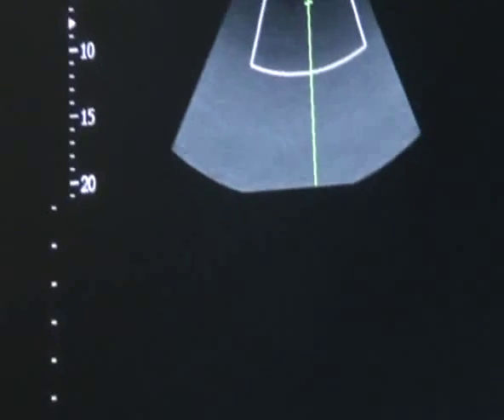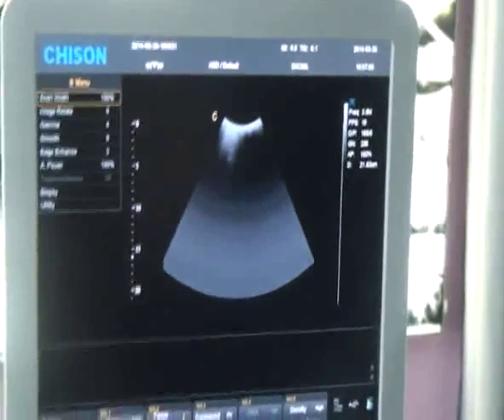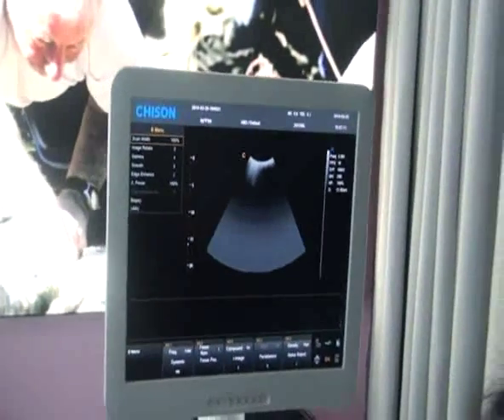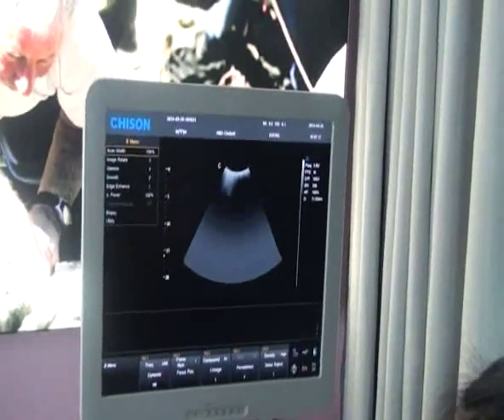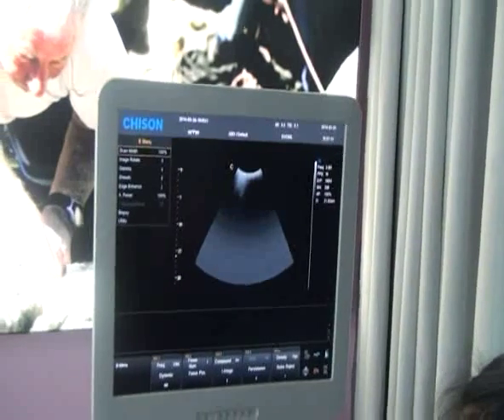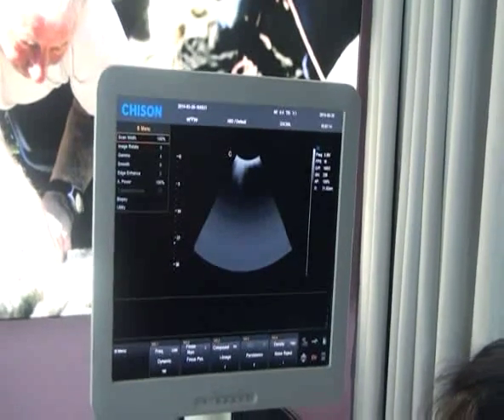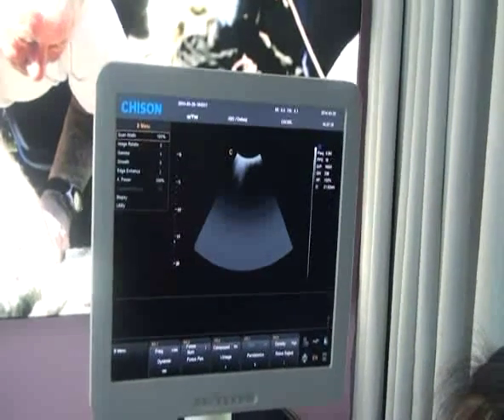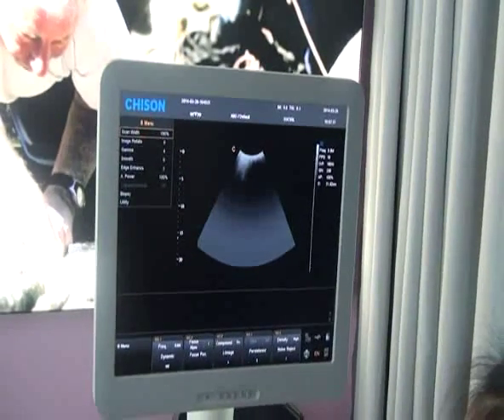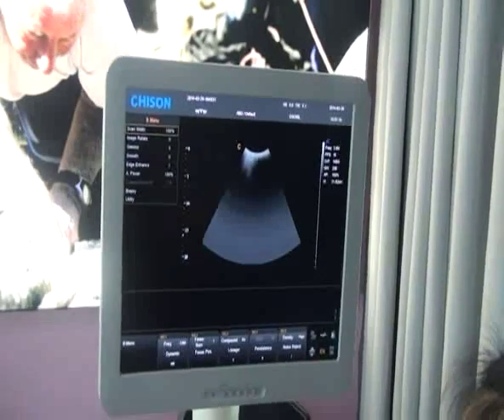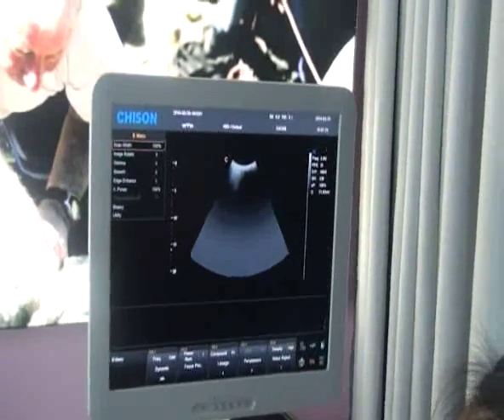After adjusting these parameters according to requirements, you can get the desired image and proceed with the following operations.